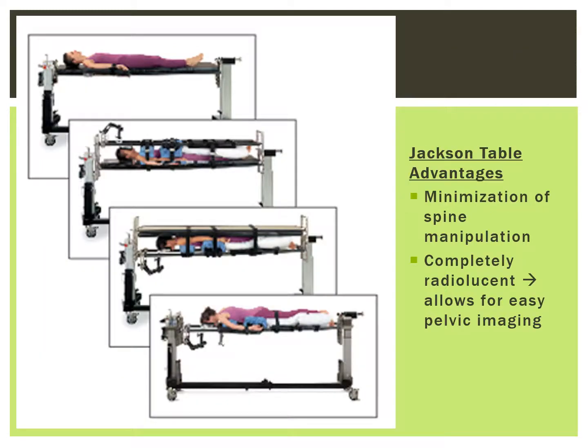A special bit of note is the Jackson spine table. Originally developed for spinal fracture patients, it allows the patient to be sandwiched between 2 plates and then rotated, all the while keeping them in a specific spinal alignment. More importantly, the bed has no central post or stem. This allows for great pelvic imaging, especially during acetabular and pelvic fractures.